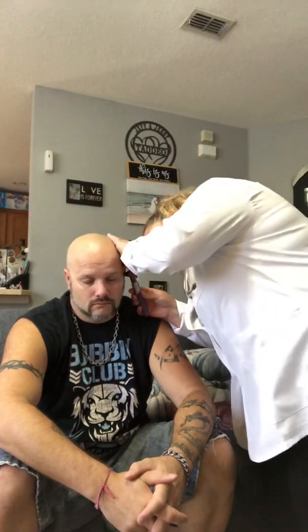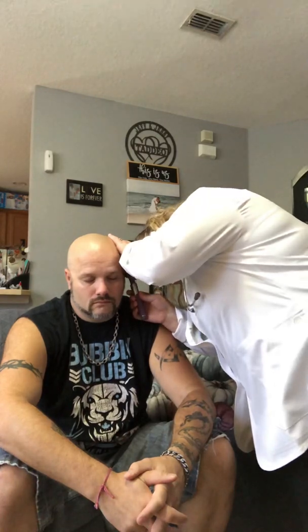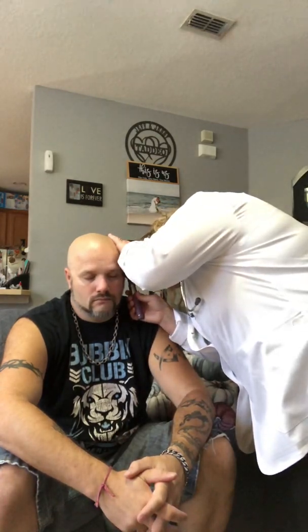The ears, we're going to first examine the external ear, the auricle, the pinna, make sure there's not any lesions, lumps, bumps, or bruises. No drainage noted from the ear, nothing abnormal on the external ear. I'm going to go ahead and take a look on the inside. We're going to look at the tympanic membrane. It should be pearly gray.